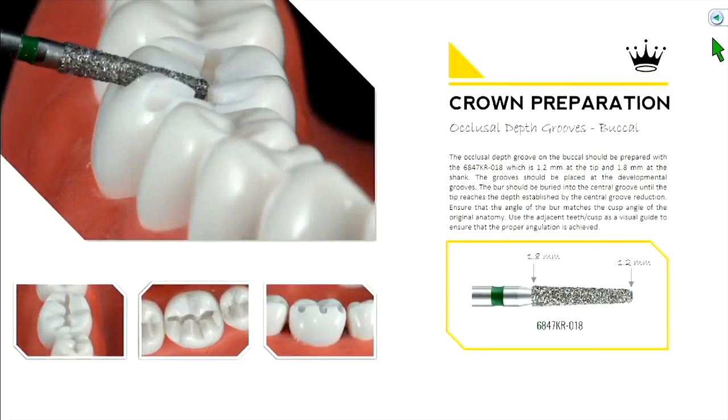Then we jump to our occlusal depth grooves, starting in the buccal. It's helpful to establish orientation or depth grooves before reducing, because if you just start reducing off the top, you lose reference of where you started. If you place depth grooves, you can see the target depth while still having enough of the original tooth surface to gauge whether your reduction was appropriate.